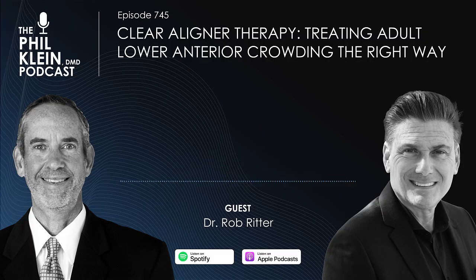There's at least 4 or 5 different teaching facilities that you can either go there and take, or at different symposiums, things like that that are given. And they provide you with a template. So when you submit your case with their template, it gets you about 50 to 75% of what the final case you would like to look at.